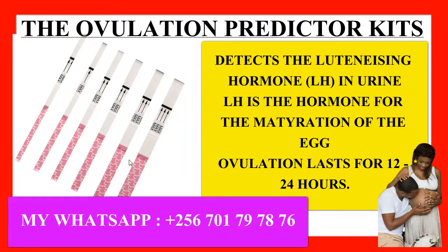You can get them at any nearby pharmacy, and your pharmacist will give you instructions on how to use them. But specifically, they use two things. One type uses saliva, and the other type uses urine.